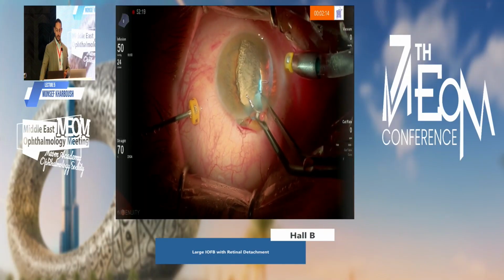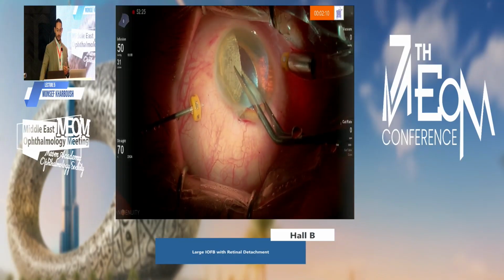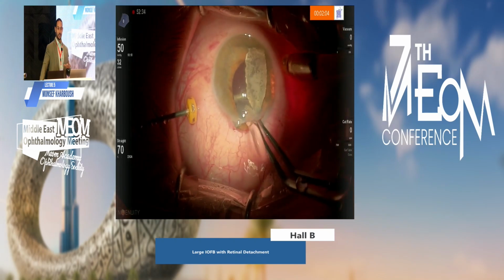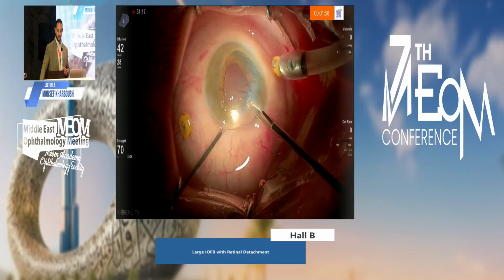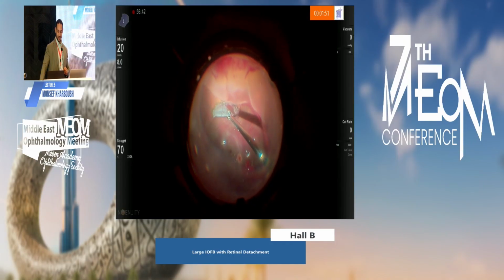And we're trying with the McPherson forceps to grasp this foreign body, but it's very large, it's slippery. You cannot have a good grasp of it. And if the iris is getting out, it's very annoying, of course. But we need to have the infusion high because there are multiple areas of bleeding. Again, trying with another 19 gauge endogripping forceps, but it fell down. So going back again with the 21 gauge forceps.